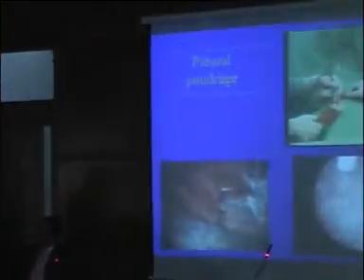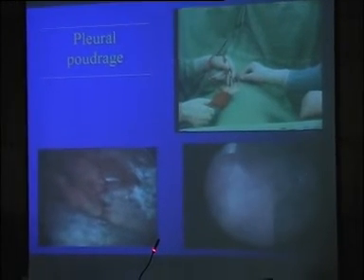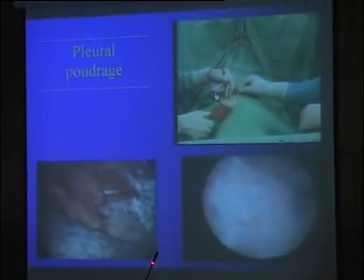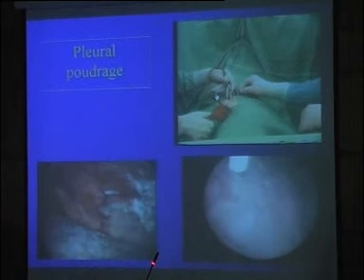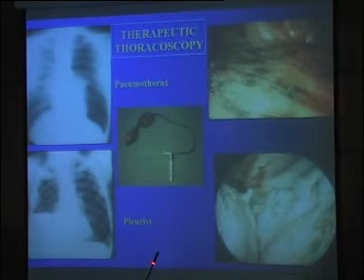It's a single balloon insufflator. You can do it with this. It takes 30 seconds to apply talc. It gently spreads into the pleural cavity. From inside, you can see this kind of picture. You see, very gently insufflated. There is no hyperpressure, there is nothing. It's efficient for sure.